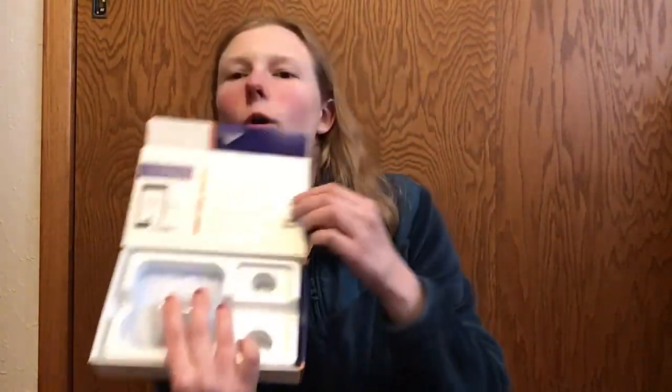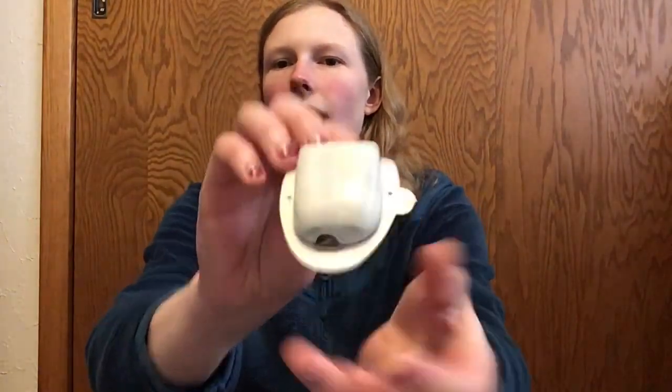There's information about the OmniPod Dash system, which is the newest type of system. Inside is the demo pod — it comes with an alcohol swab and instructions. This is what the actual pod looks like. It's a non-functioning pod — it will not prick you, it will not insert the cannula — but it mimics where insulin would be placed and where the cannula comes out. I'm really impressed at how lightweight this is. I can't believe this thing can hold up to 200 units of insulin.